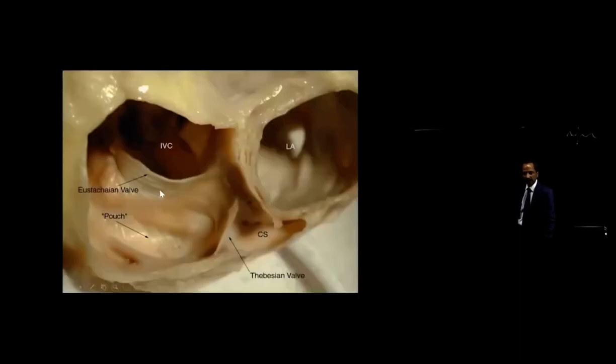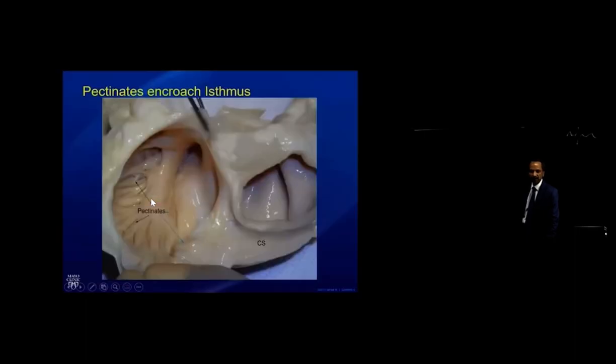It's important to have a realistic picture, whichever place we are doing linear ablation, of what's the tissue that we believe is an obstacle, that means electrically inert, like valve or IVC, and what is the tissue in between. Is it flat, or there are excavations, ridges, things that I need to simply be able to manipulate my catheter through.